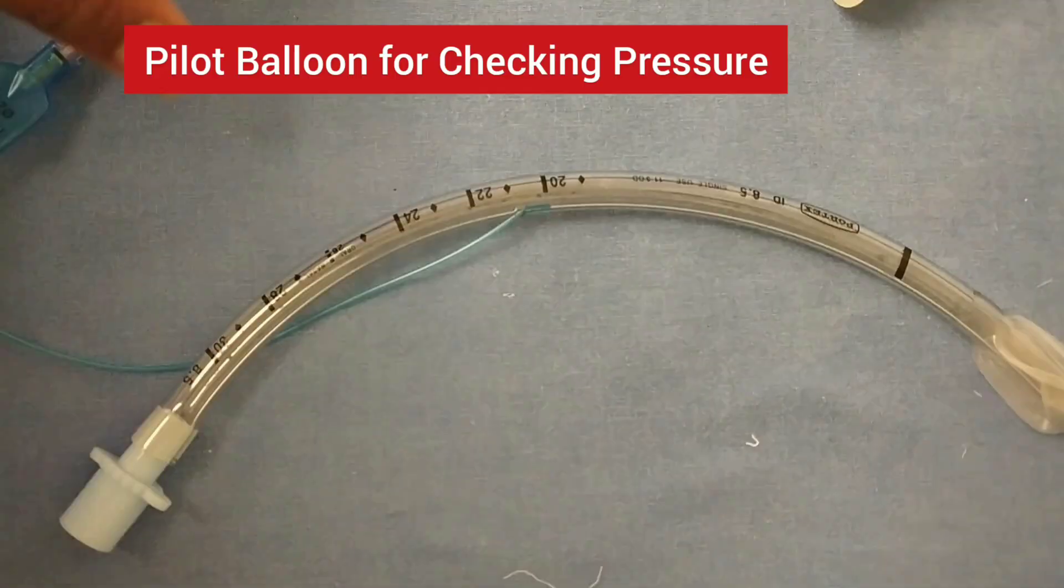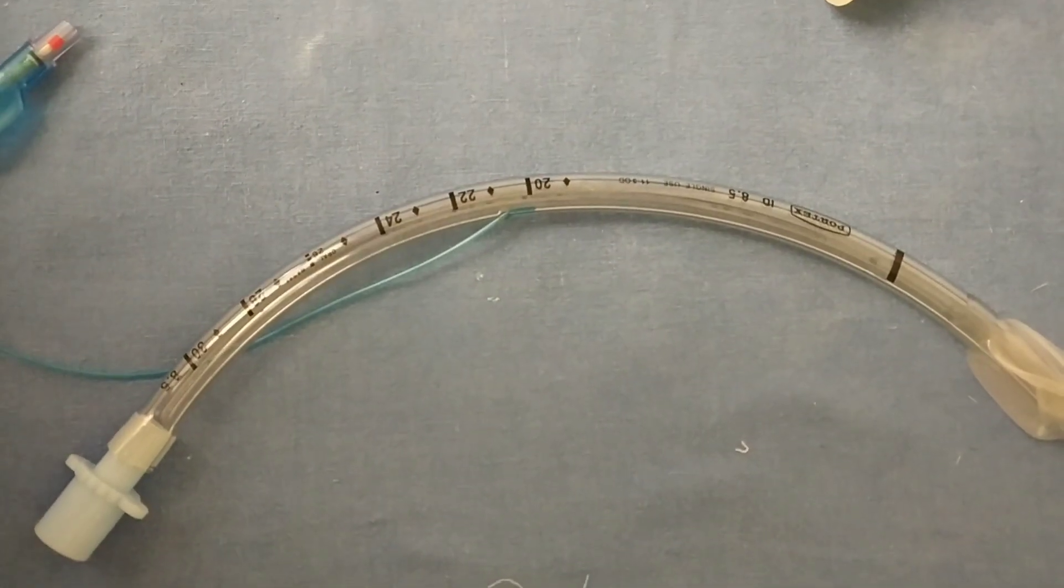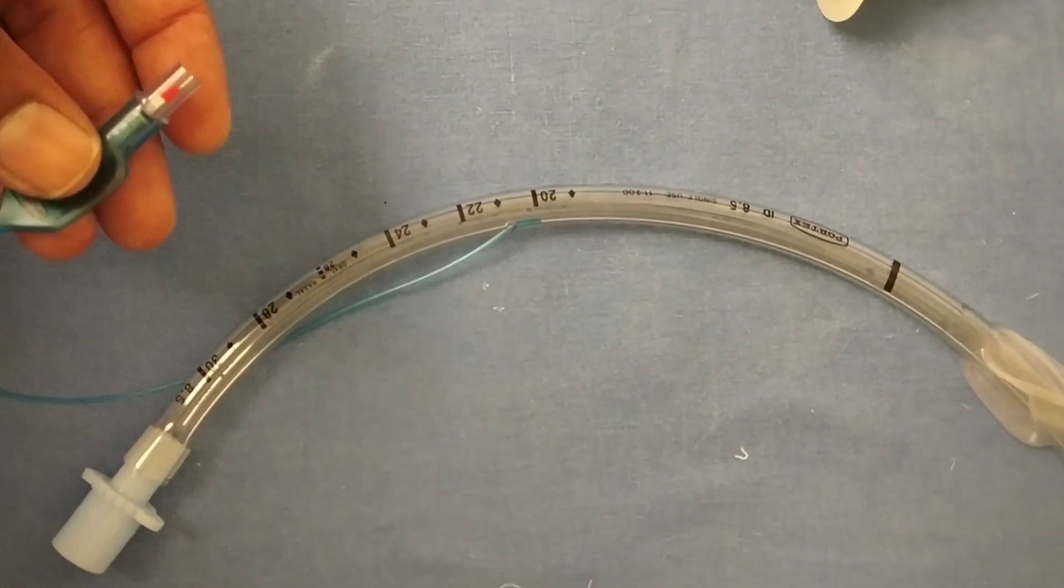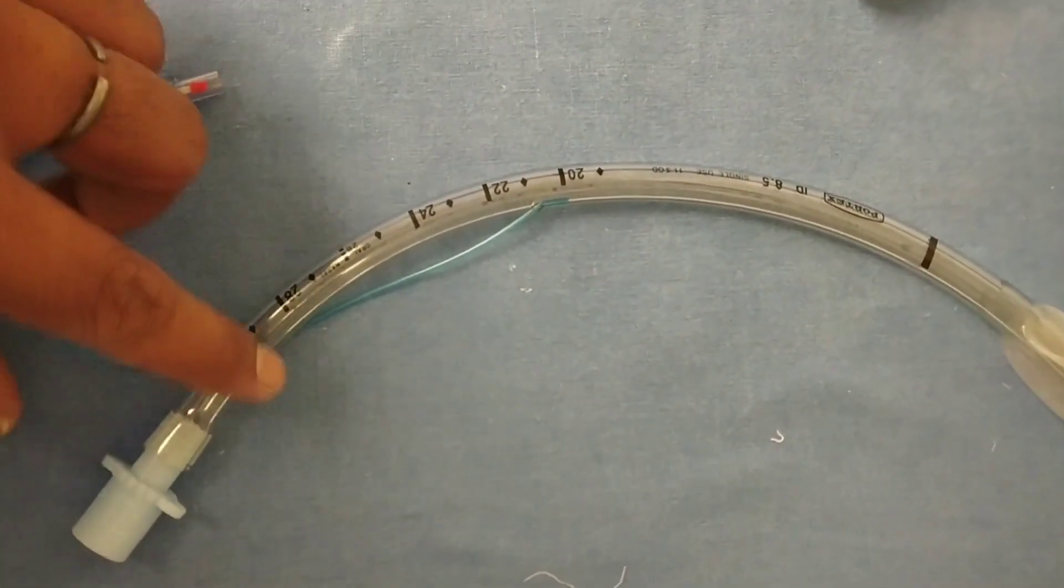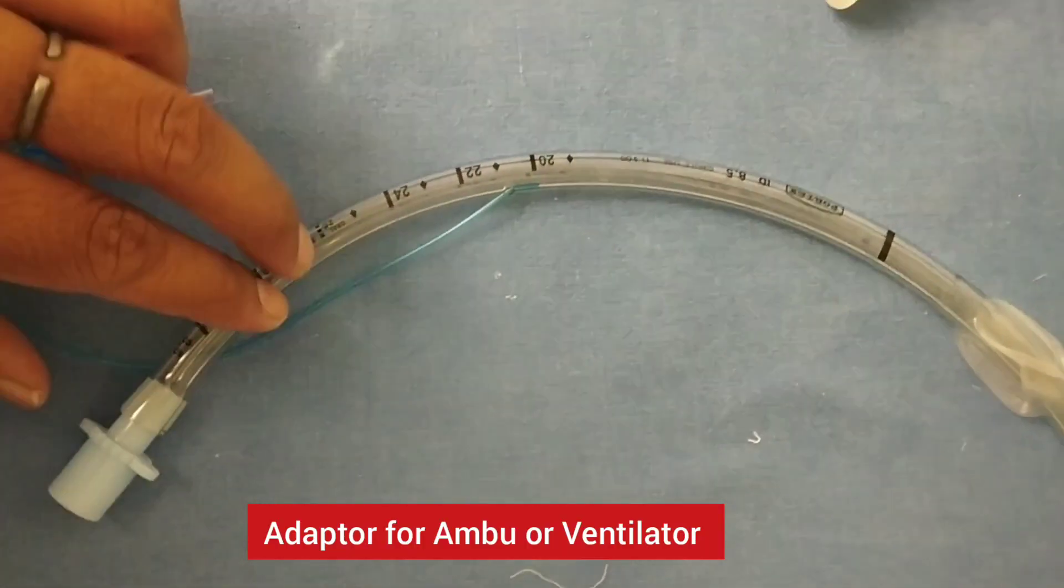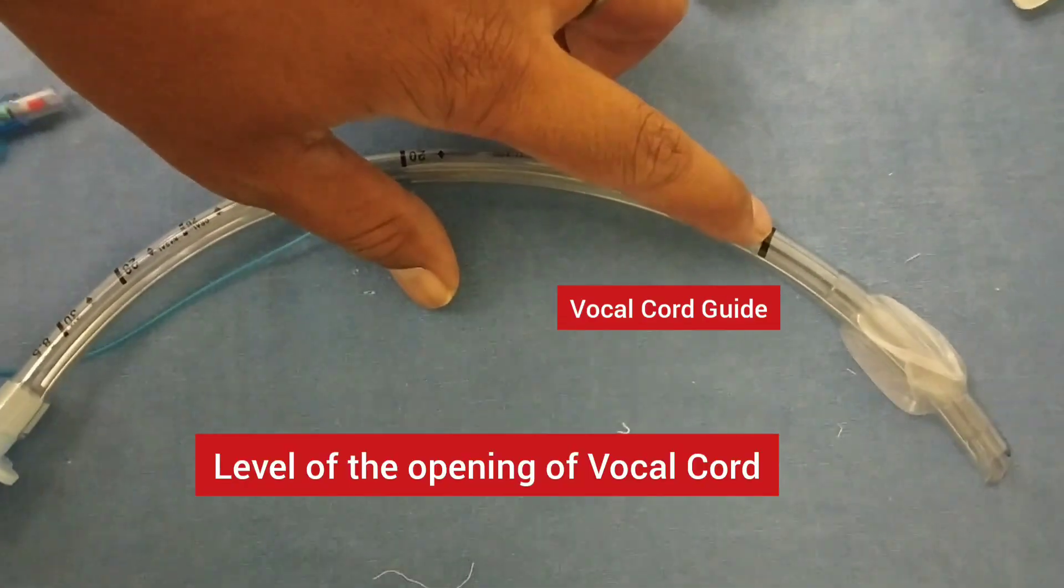These are softer, less irritant to mucosa, disposable to prevent the chances of infection, hypoallergic, and transparent which helps in visualization of the tube. The proximal end has a 15mm adapter, then there is marking including the black marking which is a vocal cord guide.